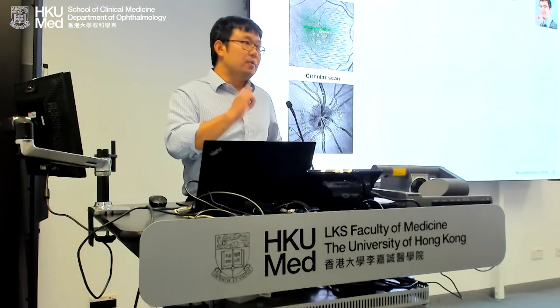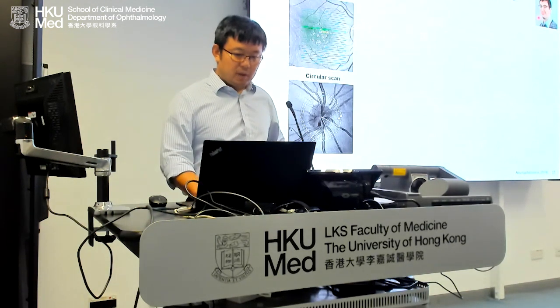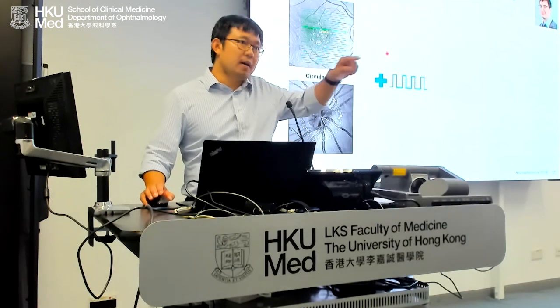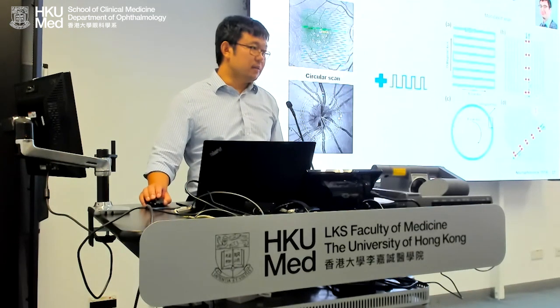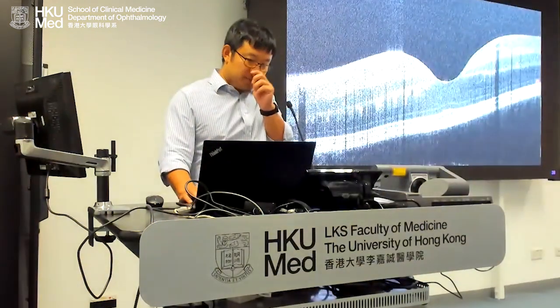Ian is another one who was hired by Intuitive Surgical last year. He proposed a high definition speckle-reduced scan. In other words, if we oscillate the optical scanning, as compared to a single line to acquire a B scan, we can synthesize these pixels to reduce the speckle. So you will see what that means.